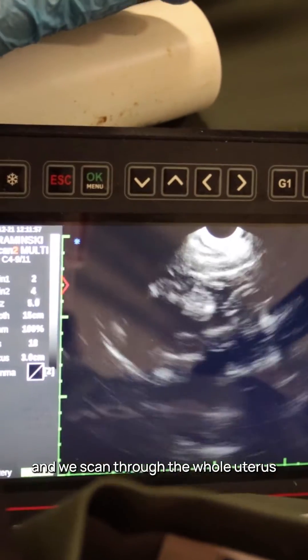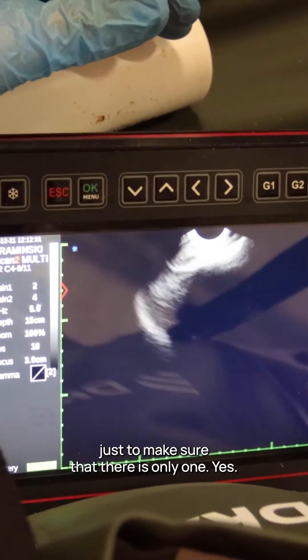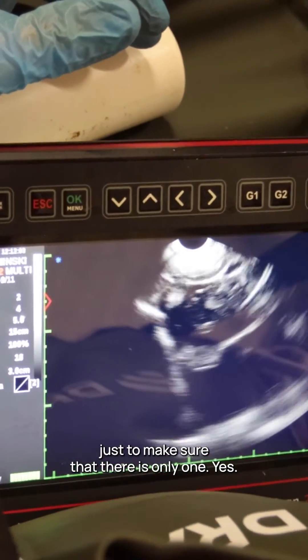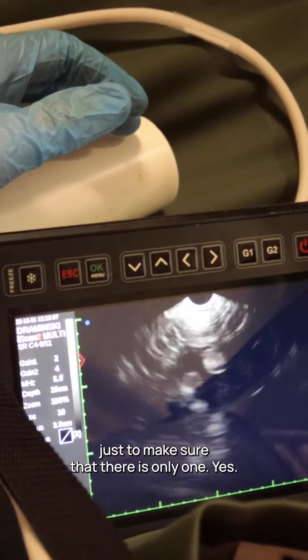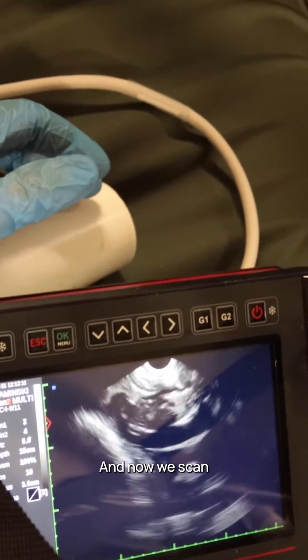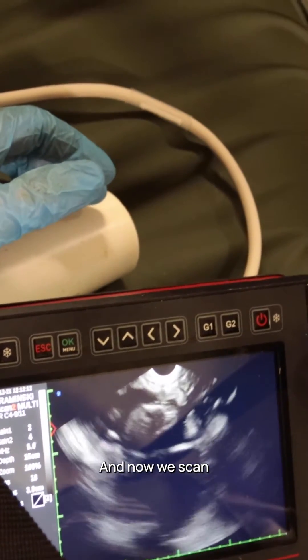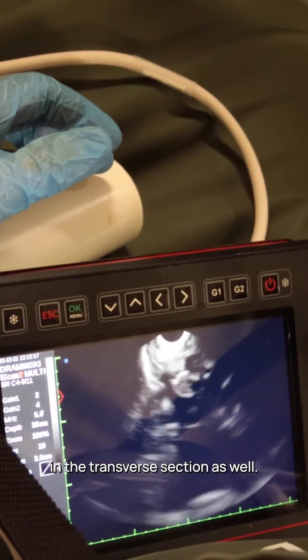So this is our fetus, and we scan through the whole uterus just to make sure that there is only one. I will scan it in a transverse section as well.